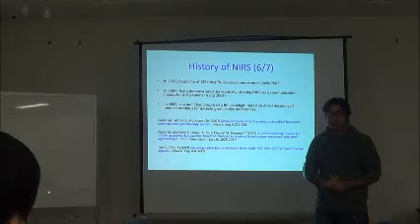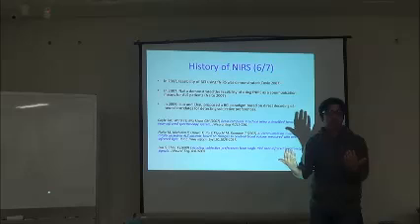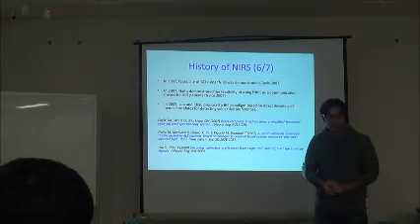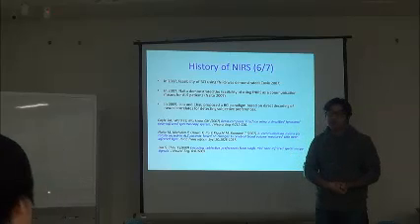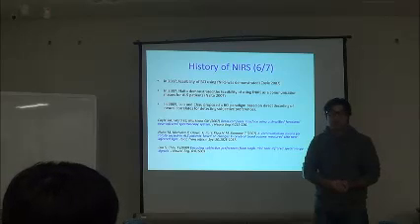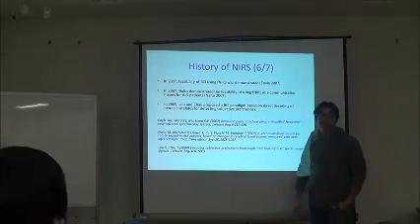In this experimental paradigm, they presented two different kinds of drinks, and the subjects were asked to mentally evaluate which drink they liked. Based on the data acquired by fNIRS, they could classify with an average accuracy of around 80% which drink the subjects preferred.